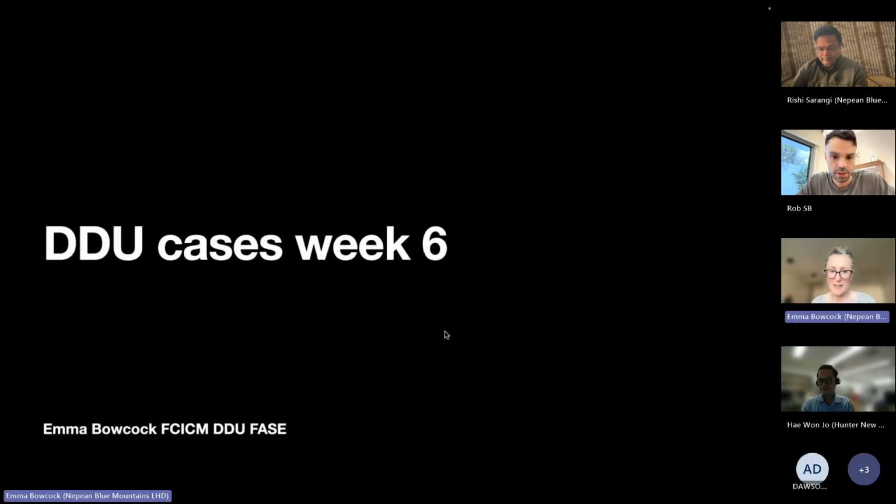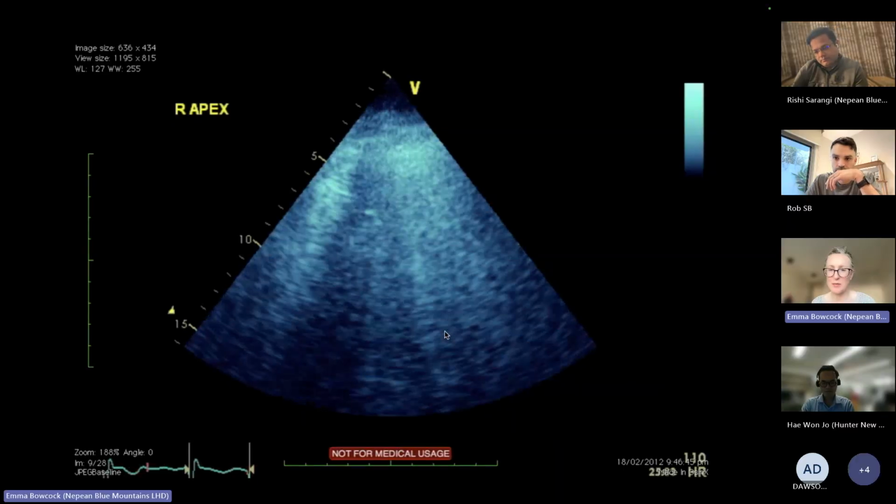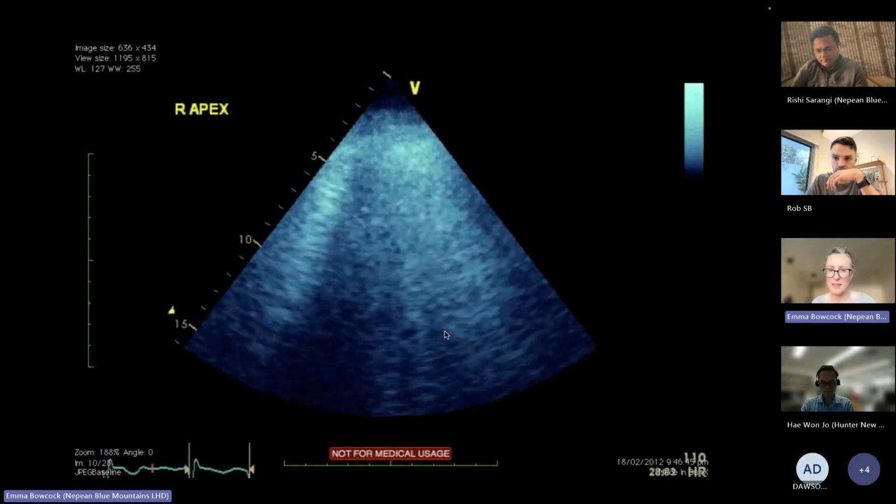Cool. All right, we'll end that point and shoot one. Nice one. I think you said everything there, Rishi. Did anyone have anything else to add?